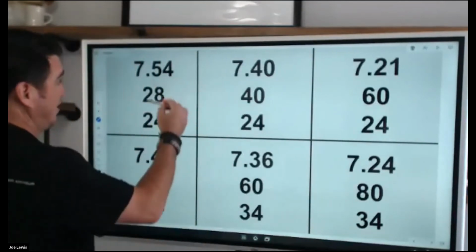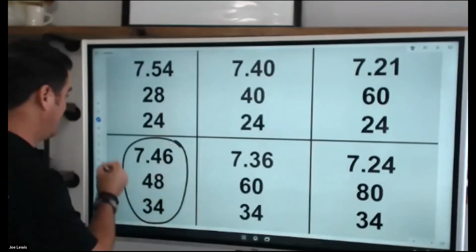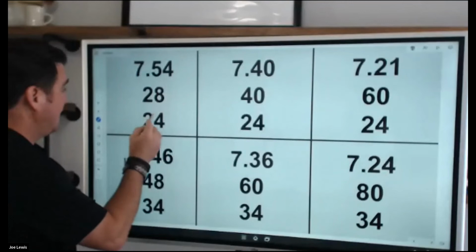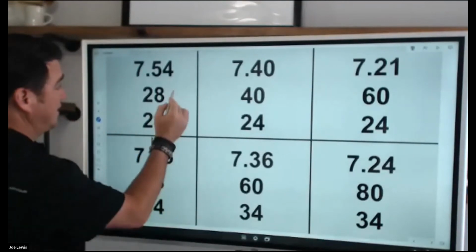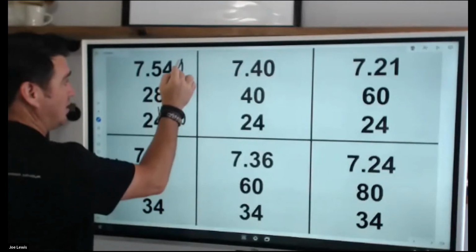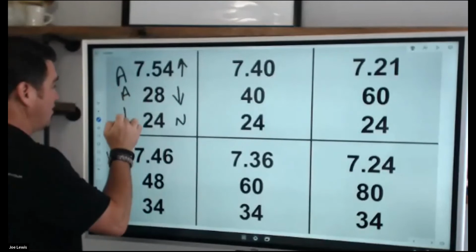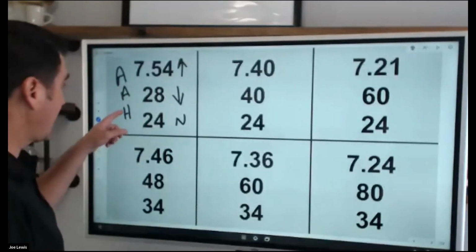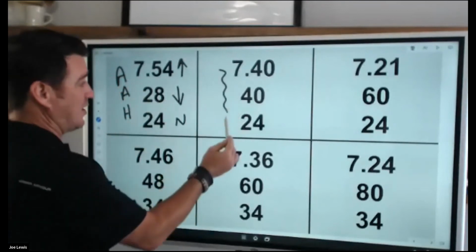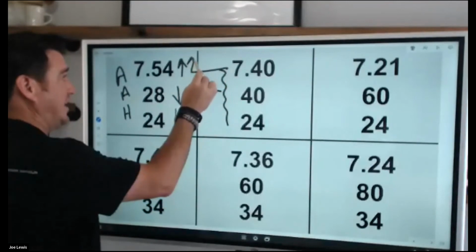So we're going to start here and I'm going to move this away. Remember I told you this is the trickiest one right here, right? So we're going to finish on that one, okay? So here we have a normal bicarb, a low CO2, and an alkalotic pH. Remember what we called this? Acute alveolar hyperventilation. Perfect. That's what we called it. Why? Because this is our normal starting point. CO2 went down, pH went up.